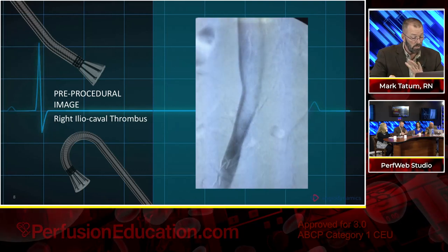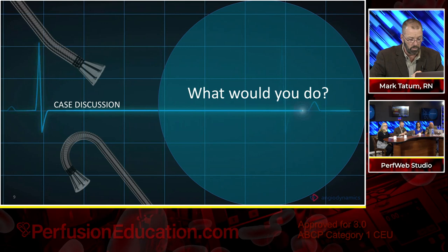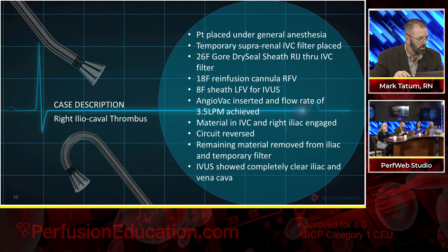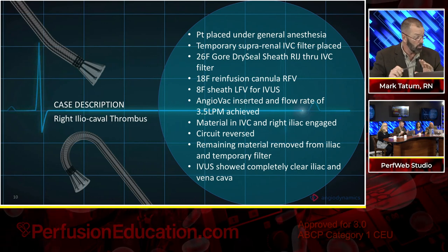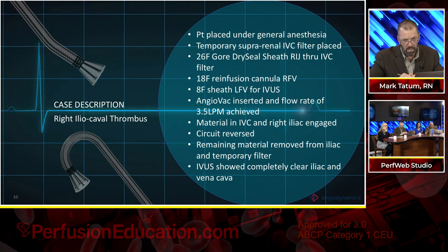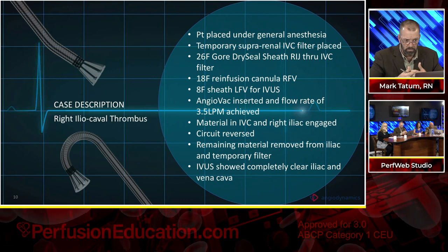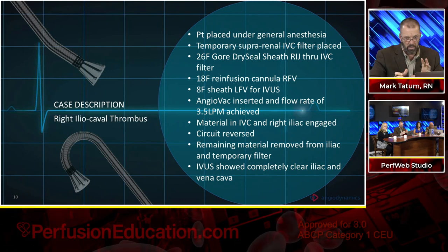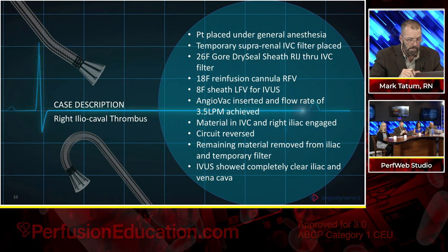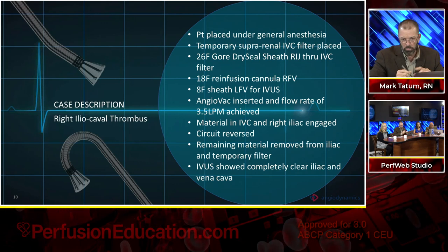So let's move forward and show what we did in this case. We're going to go to the next slide, please. Okay. So, general anesthesia. Most of the cases that we do are done under general anesthesia. Not all. It is our recommendation for any of those cases that are going to happen in the IVC space, those typically are our longer cases. If you were to look at cases that happen in the caval atrial space through to the pulmonic valve, those cases normally, stick to stitch, are about an hour to an hour and 10 minutes.